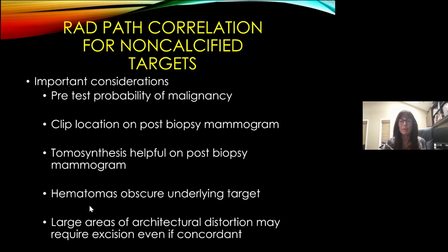In these patients with non-calcified targets, a post-biopsy hematoma may obscure your underlying target. And so if the diagnosis is benign breast tissue and you targeted a mass, it may be useful to have the patient come back in a couple of weeks to make sure the clip is in the right location after the post-biopsy changes resolve.